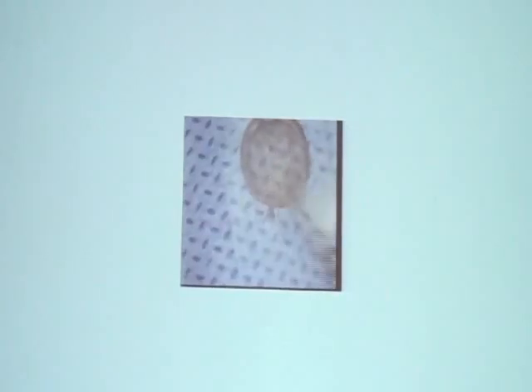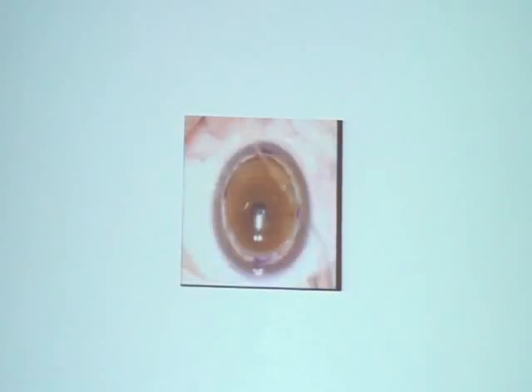The donor tissue punched out for keratoconus cases is usually the same size. You peel off the Descemet membrane. You can either directly peel it off, or you can use a Merocel sponge to remove that. You can even stain it with trypan blue at this point of time. And this is placed back in position.